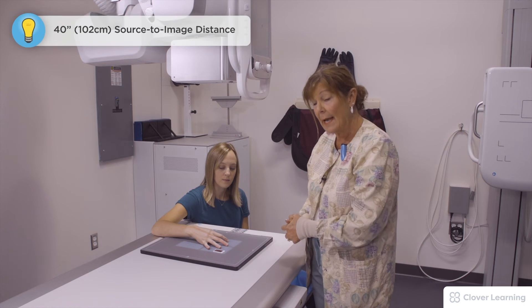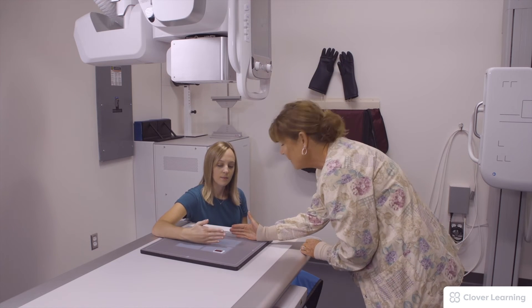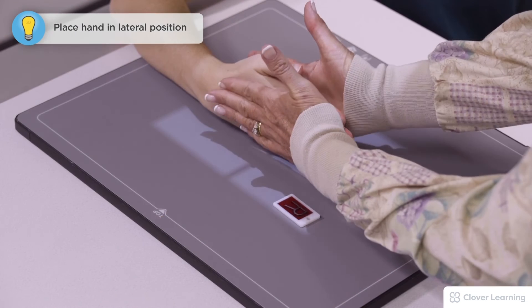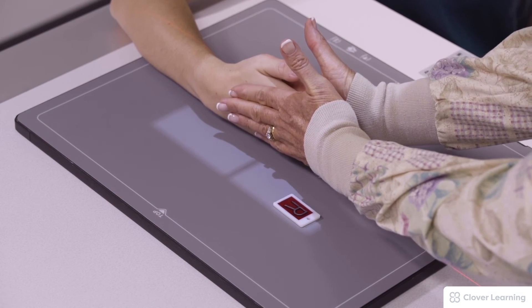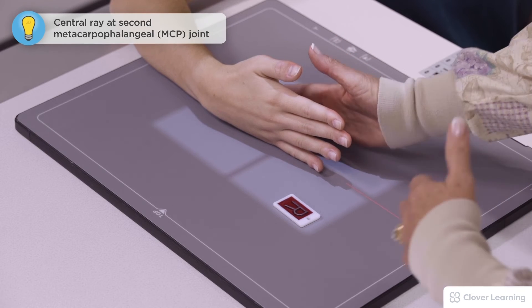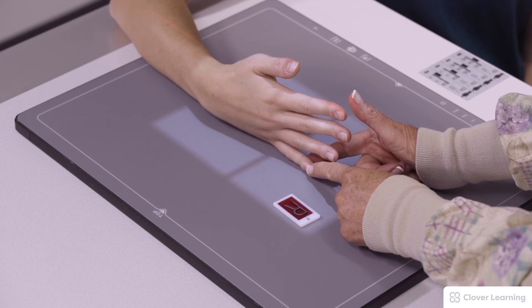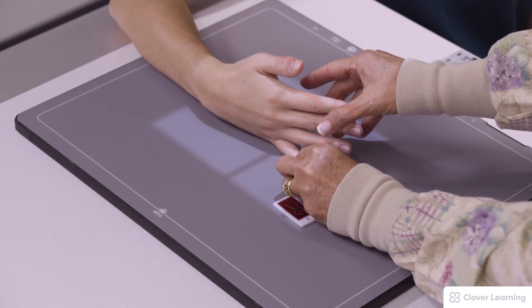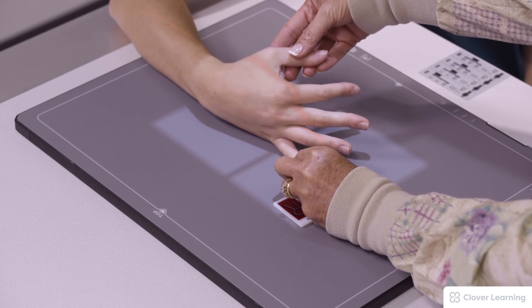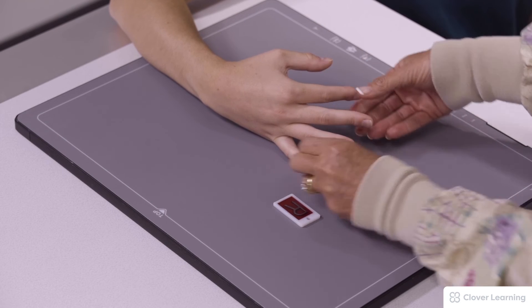Lastly we're going to do the lateral. We're going to place the hand up on its side and do the fan lateral, which keeps the metacarpals at 90 degrees. This is a great view to show fractures and foreign bodies. Keep the little finger out and stair step every finger so you can see each digit in the lateral view, keeping the thumb very straight.